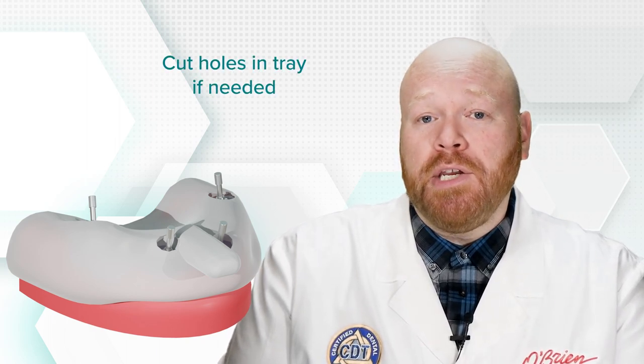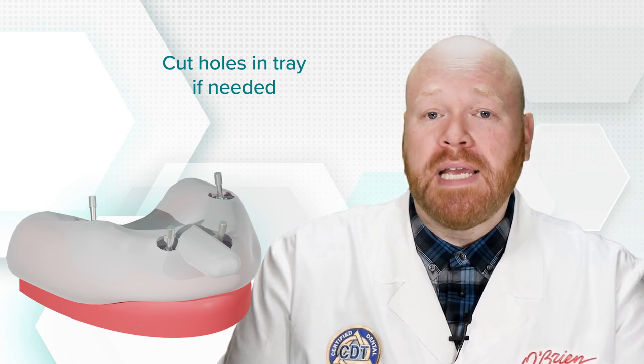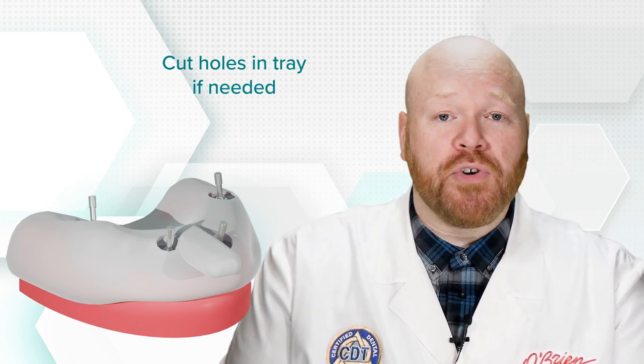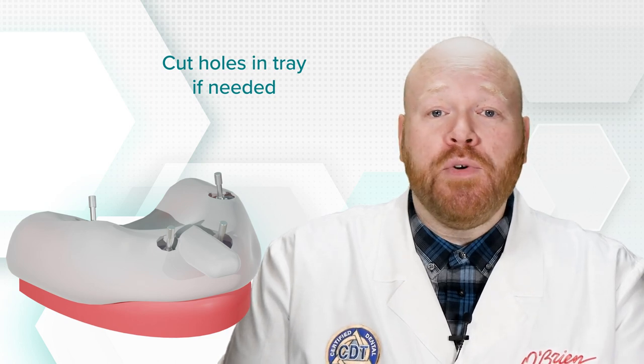Next, you can grab the custom tray you would use to take the original impression and take a new impression over that verification jig. If your original impression was closed tray, you'll need to cut holes in the tray before taking the impression so that the screws can be accessed and removed before pulling the tray. At this point, you can send the new impression back to the lab, or if the jig had passed verification with no issues, you'll return that to the lab.